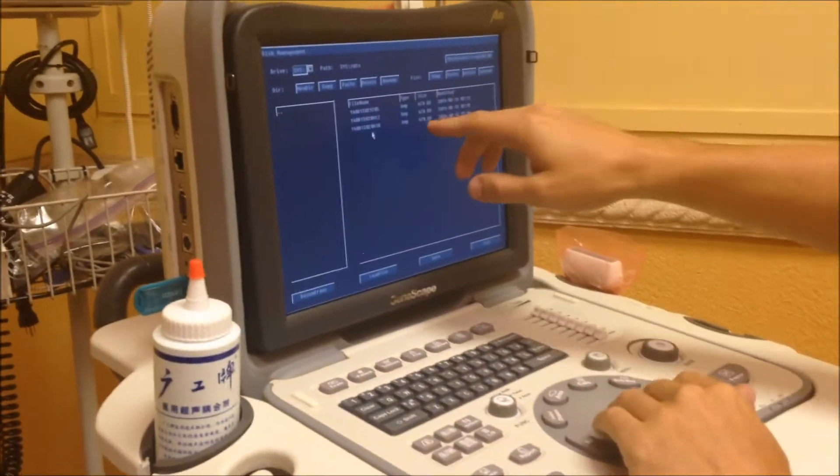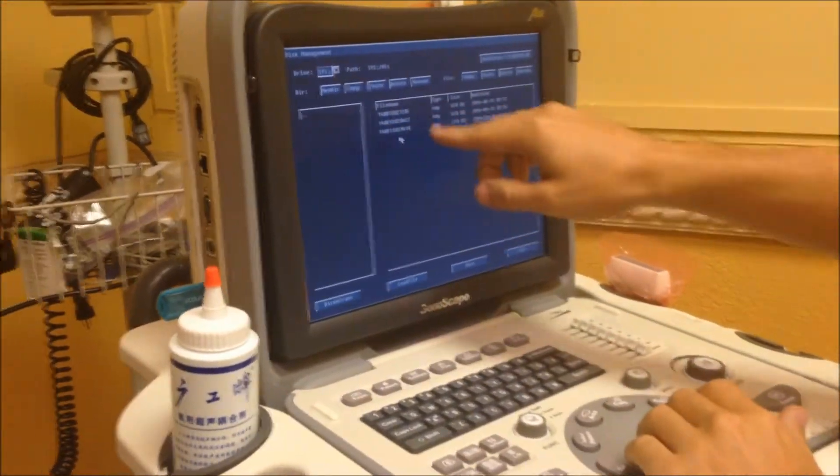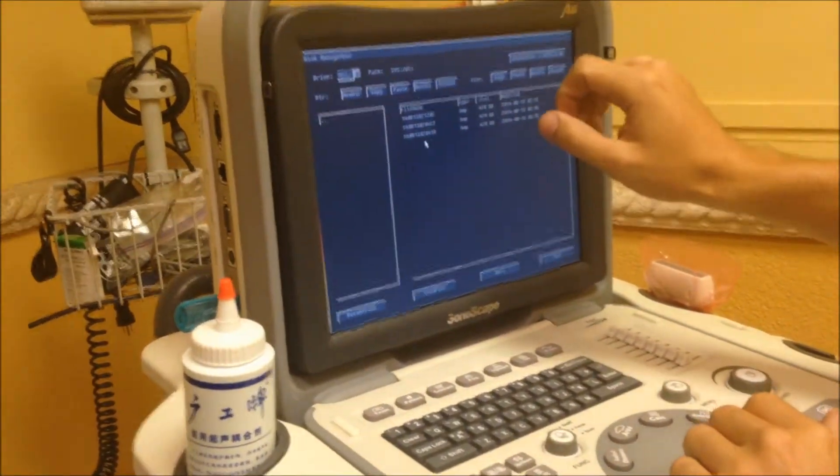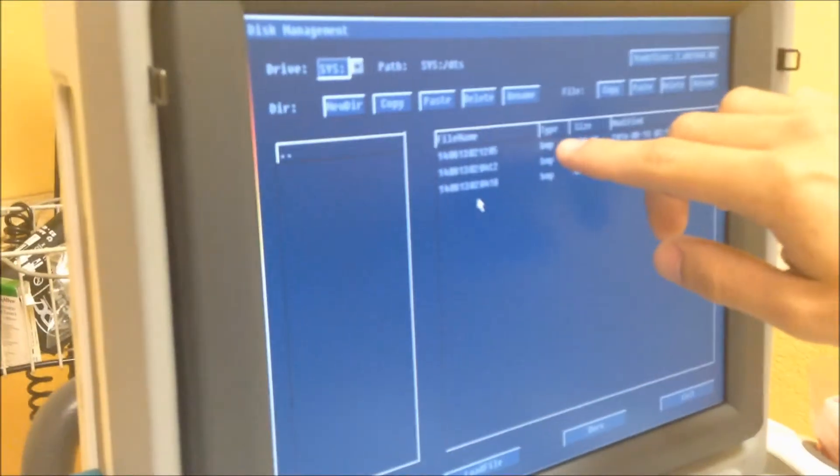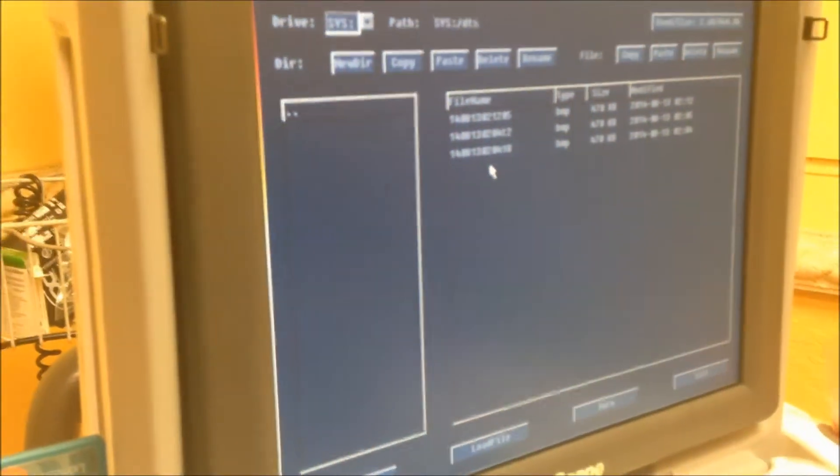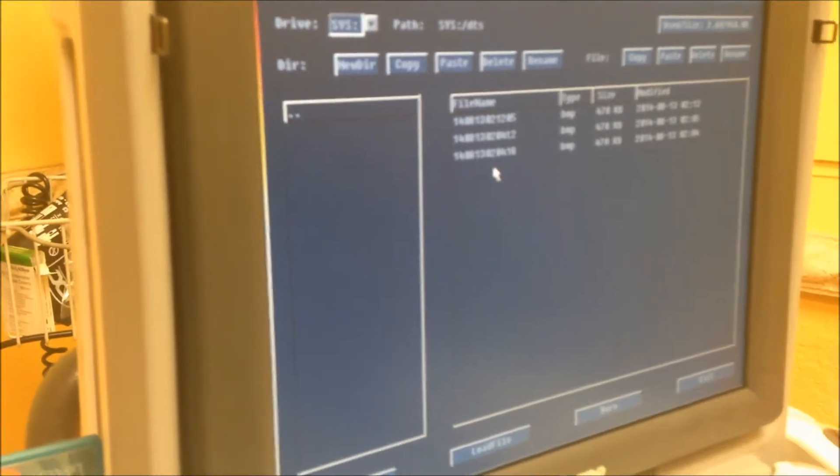So we see here all the pictures that we took. It's only three of them and they're in the type of bitmap.